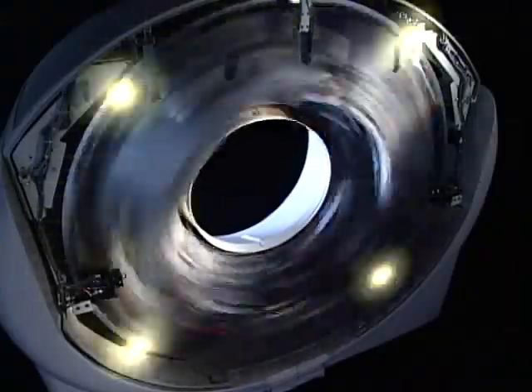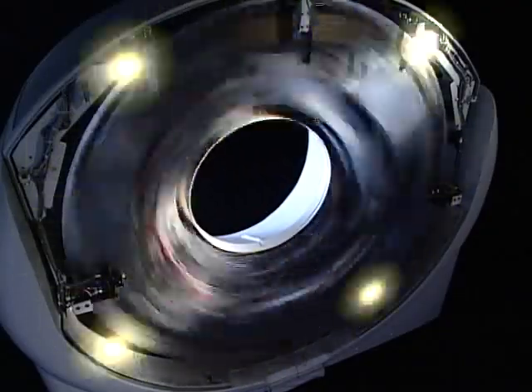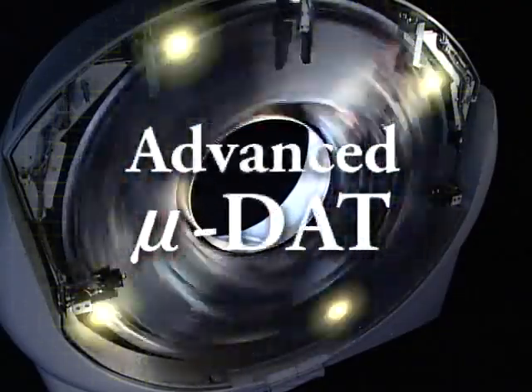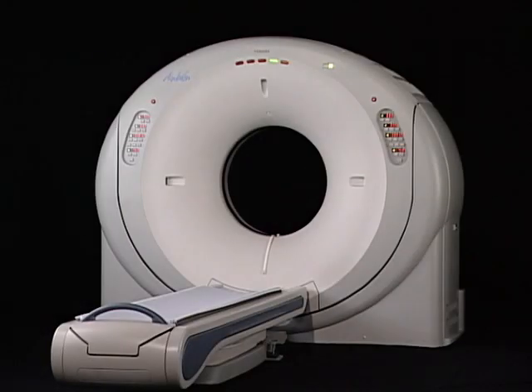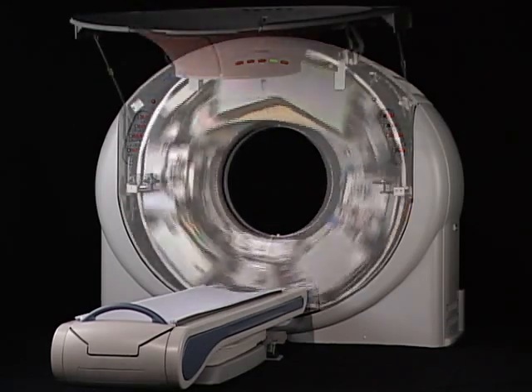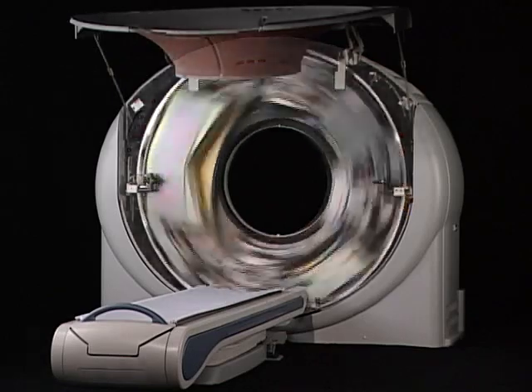To eliminate friction noise, data from the rotating frame is sent by a non-contact system of optical data transfer, MUDAT. Thorough noise control to prevent noise from mixing with the faint detector signal, another precondition for achieving the half-second, half-millimeter slice.